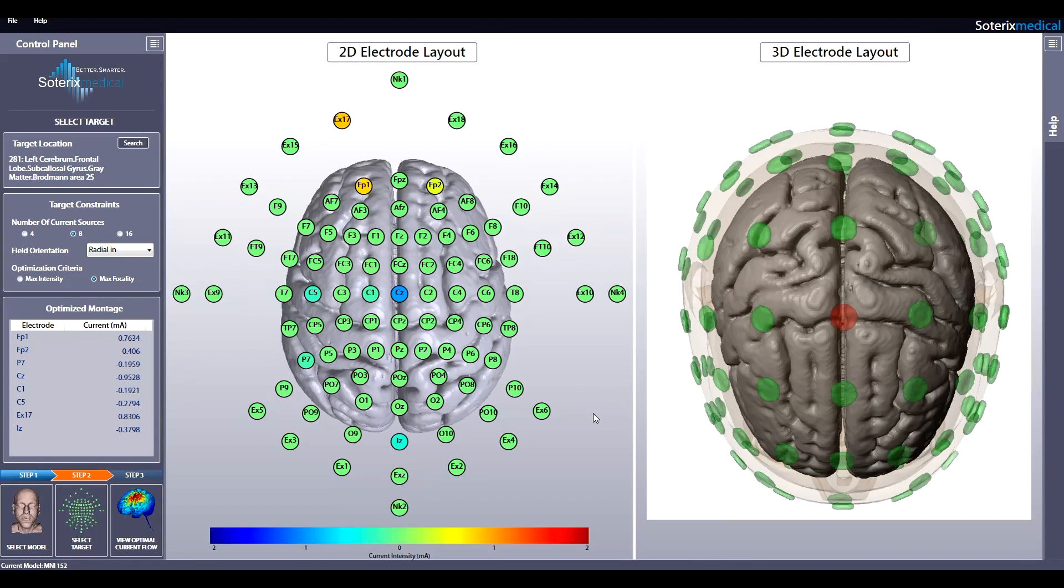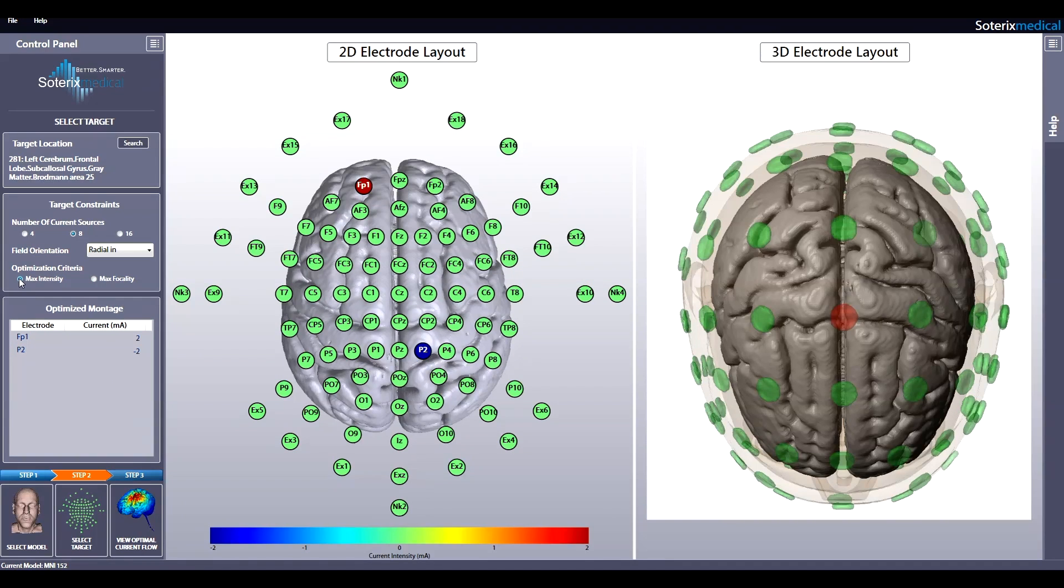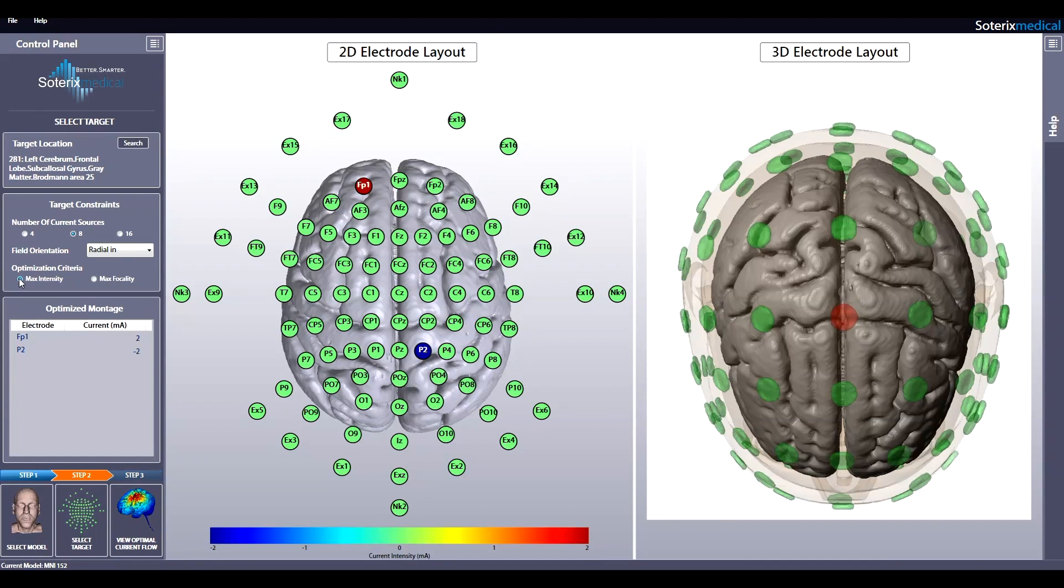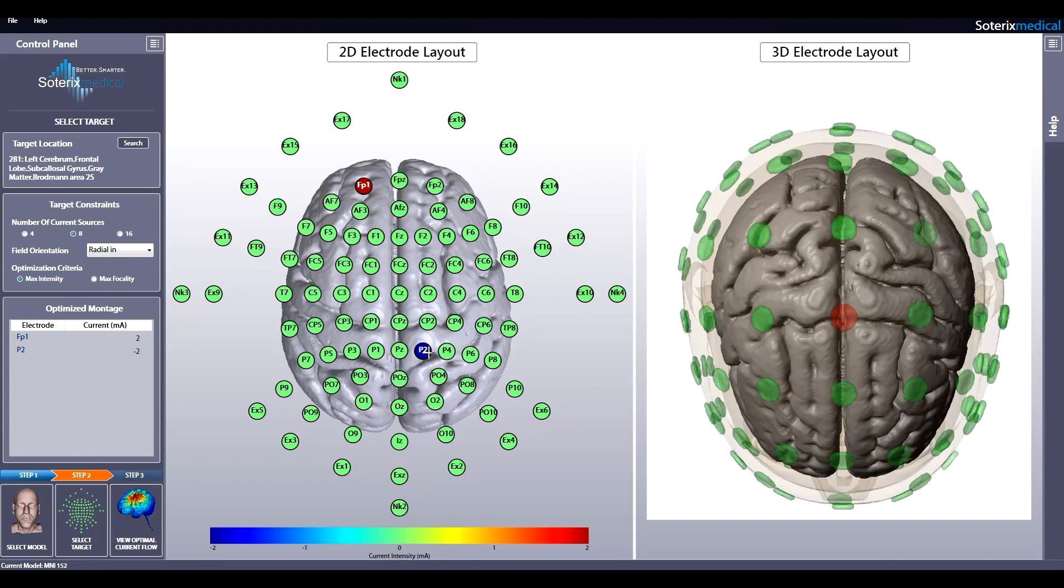Now let's say you're interested in the maximum intensity prediction. Observe how HD Targets will instantaneously update to provide the most optimal electrode montage. In this case, the prediction is bipolar with anode at FP1 and cathode at P2. Let's go back to maximum focality.